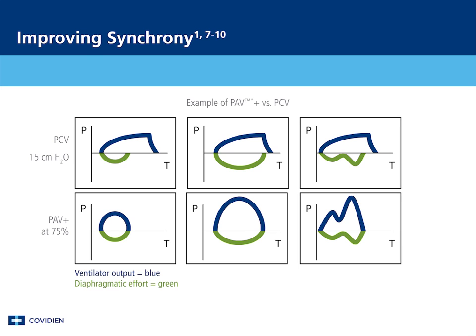The ventilator applies the same mechanical breath each time. With the PAV Plus option, the ventilator adapts to patient efforts. If the patient pulls gently, the machine applies gentle pressure. If the patient pulls aggressively, the machine applies more pressure. Furthermore, notice how PAV Plus software synchronizes with the end of inspiration better than pressure control ventilation.